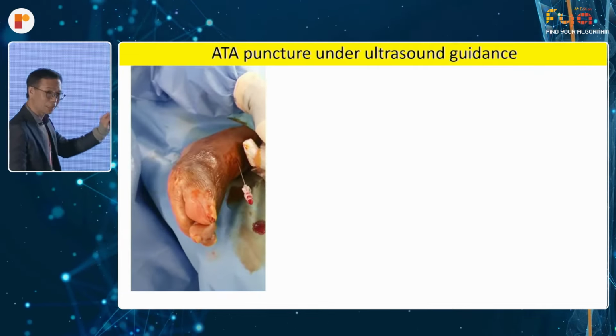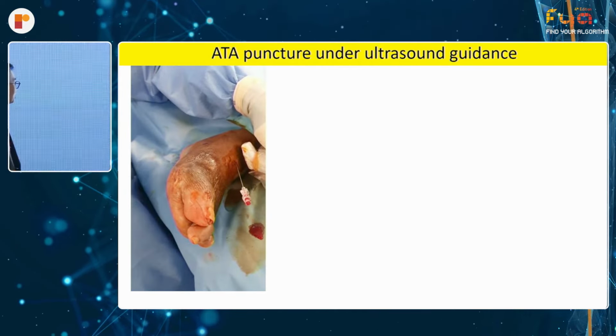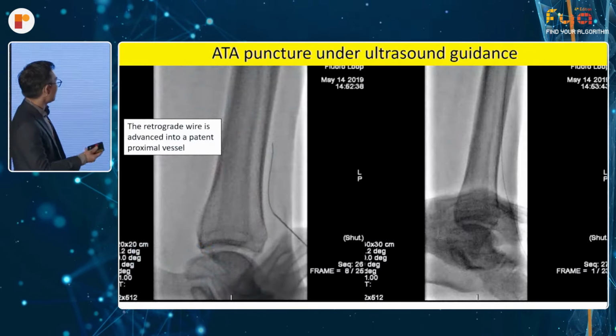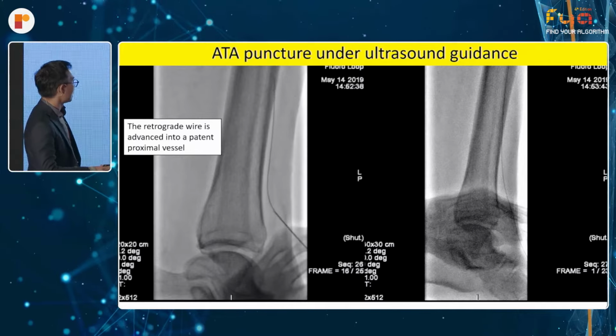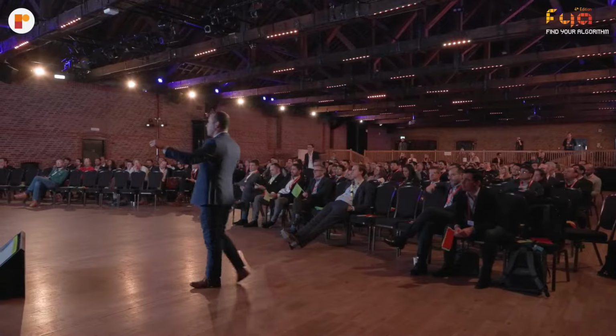It's a bright red. Sometimes you can get into the vein, and that's the vein color, so you know you're in a vein. And from there, you advance the V18. Sorry, I'm interrupting you again. Can you show the video again? Yep. Because this is so important.